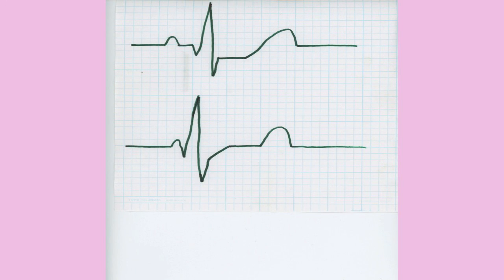So again, this is a good time to try these and maybe slow down or pause my reading of this and try this on your own. If you look at the next one down, this is just on that same slide below the first one, you have again no TA wave. So where the top of the Q wave, or if you look at before the P wave or after the T wave, that's all your isoelectric line, your baseline. We've studied that early in the course. And then you want to find that; that'll be your top line.